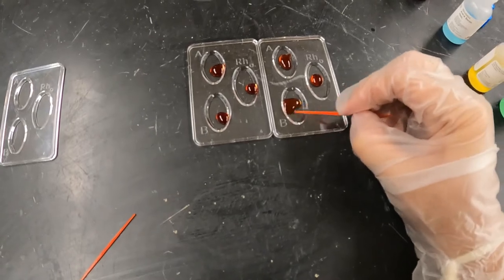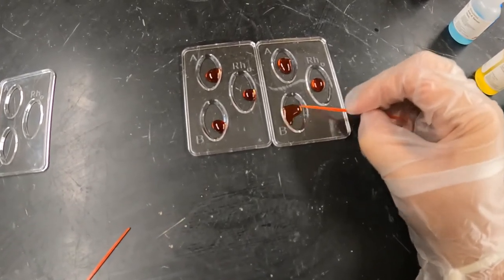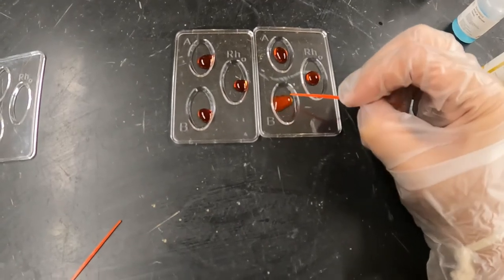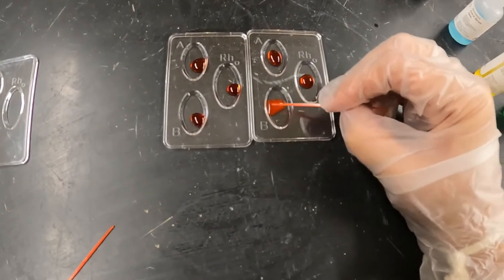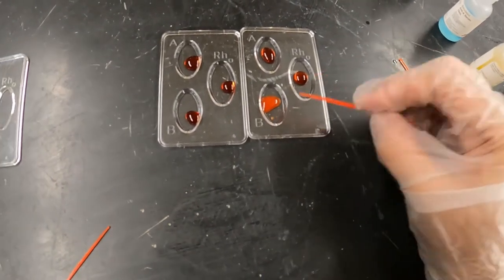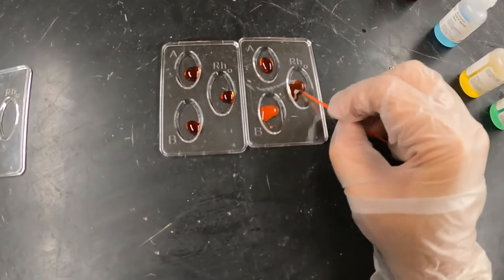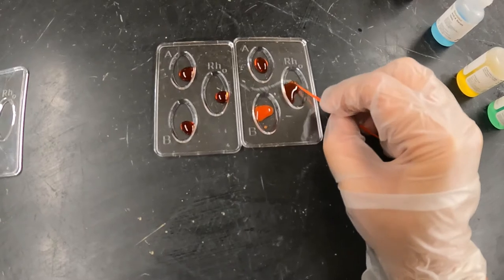Mix it up for B, and you can see for B it's starting to change color, and you're starting to see some of the cells kind of come together.